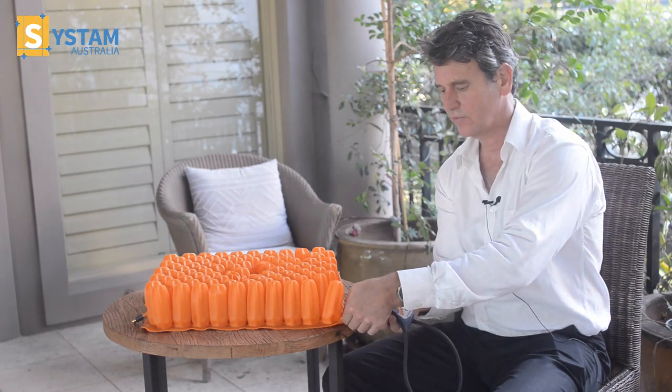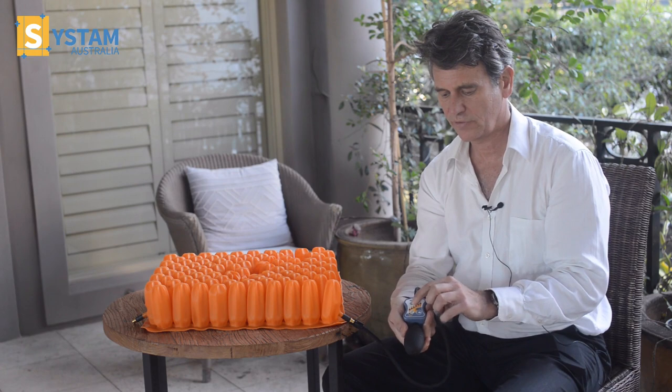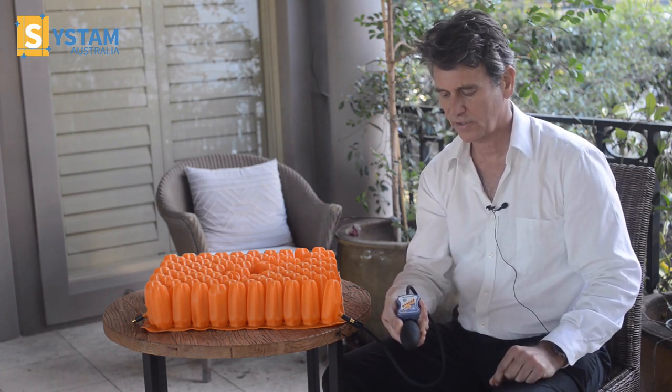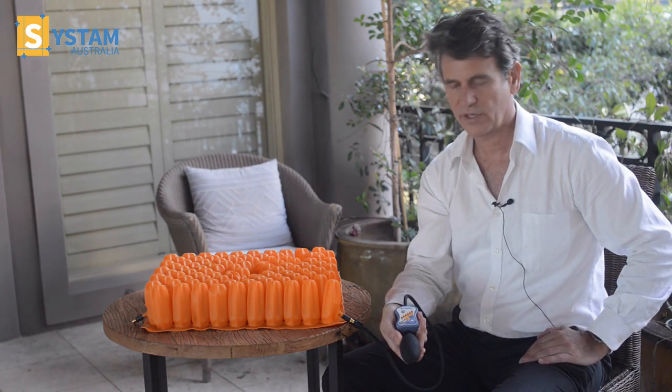I'm connecting the valve up to the hose of the pump. The pump I just turn on with this button up the top. It calibrates for about three seconds and then settles. This bottom light should be flashing before anybody sits on the cushion for our setup process.